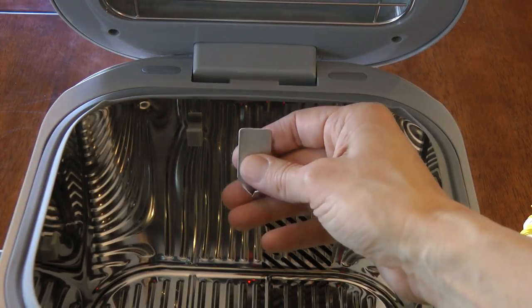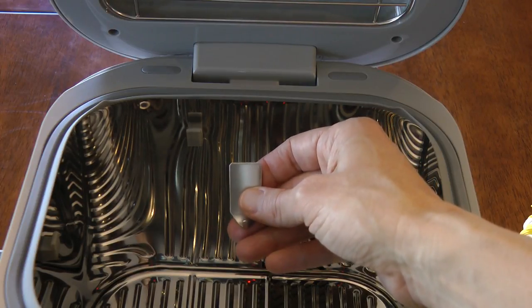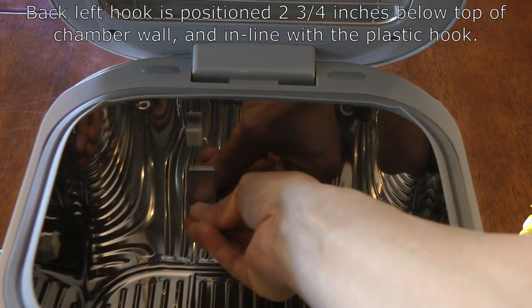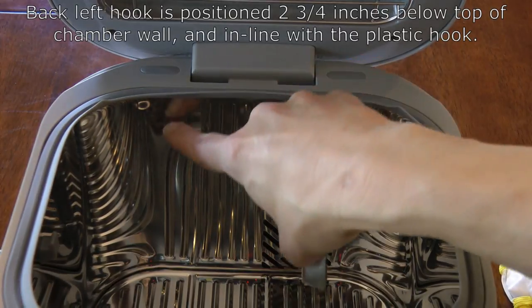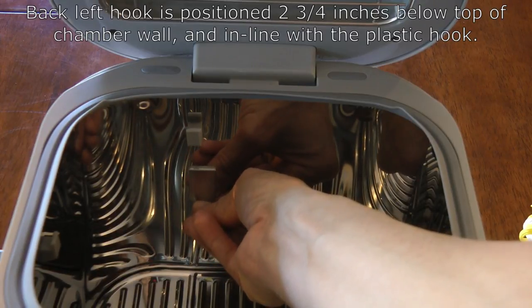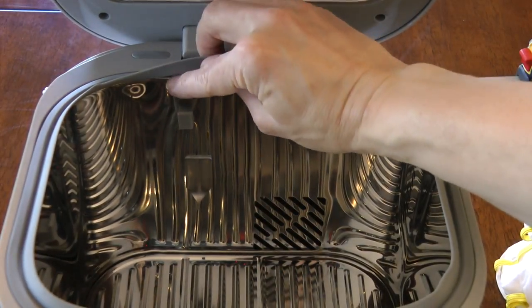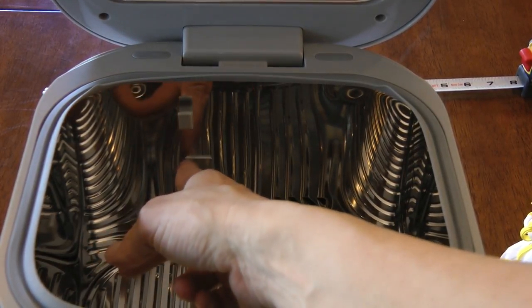For the two back hooks: align the leftmost hook with the left side of the plastic hook that comes with the sanitizer. Place the top of the hook 2 and 3 quarter inches from the top of the sanitizer. Push the lip up a little bit and measure 2 and 3 quarter inches down. I've gone ahead and placed the first hook — from the top of the sanitizer down is about 2 and 3 quarter inches, roughly in line with the edge of the existing plastic hook.